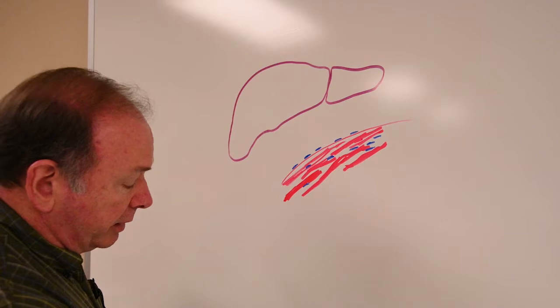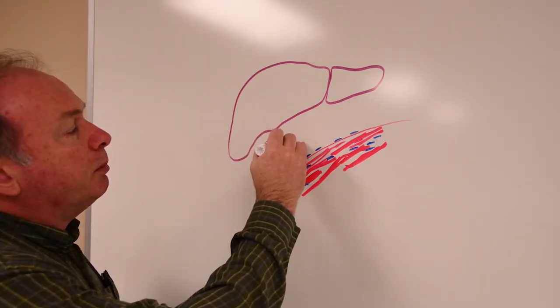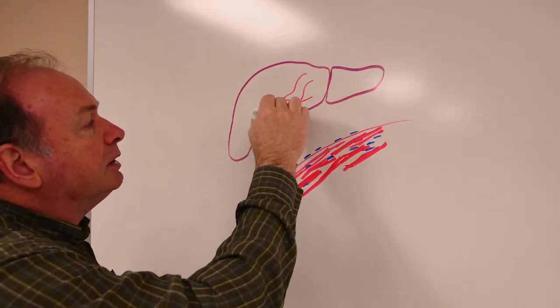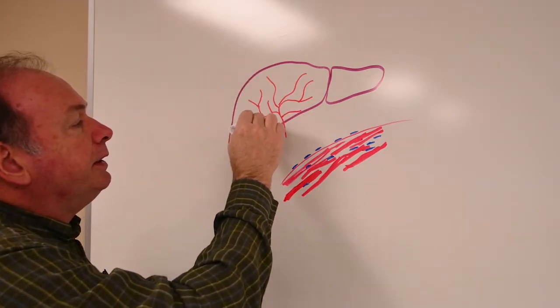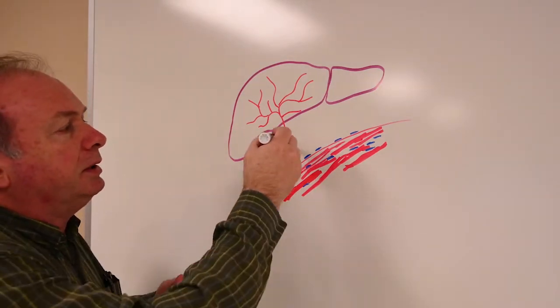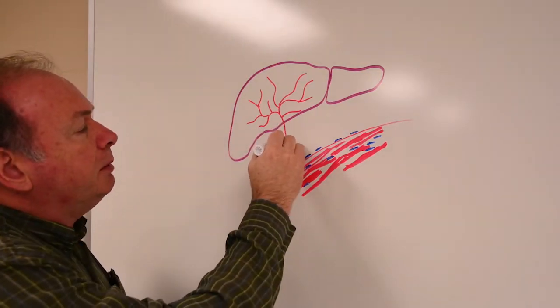Coming up on the underneath side of the liver here, remember we have a location where blood vessels will enter into the liver and then branch out and go their different directions to get to every part of the liver, to supply the liver with all of the blood in there. And there's another vessel carrying portal blood. I'm going to put it in blue, but we usually do try to do it in a yellowish color, but this will show up better.